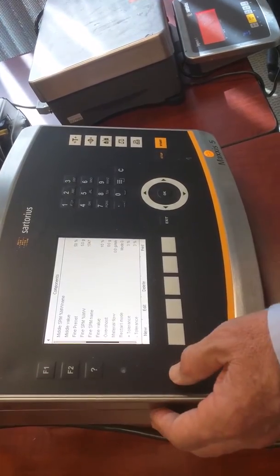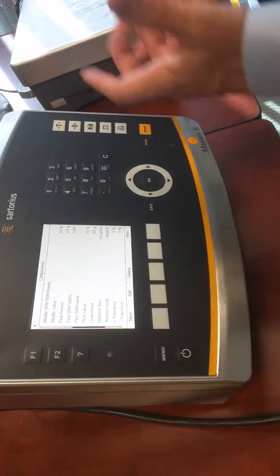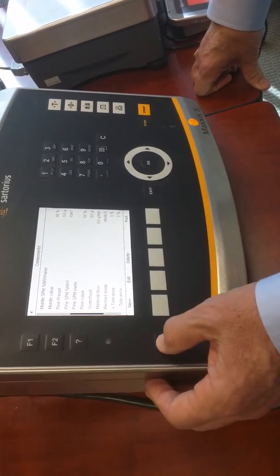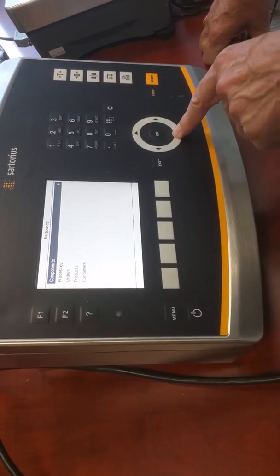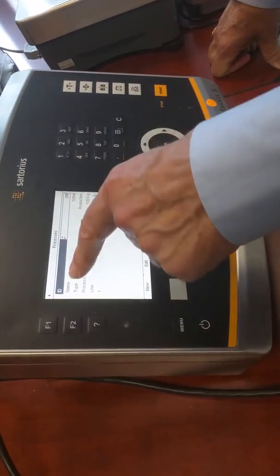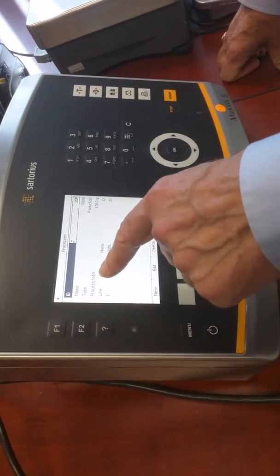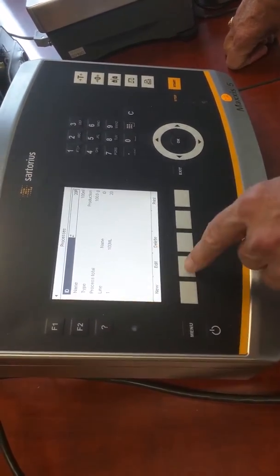So it puts some limitations on what you can select for a fill volume. You'd think that you'd need to be at least above 10 grams in order to make this work, otherwise it'd never get to 100%. So we'll hit exit, and we'll go to processes, arrow down, hit OK. All right, and so 20p, that's the ID, supposedly 100 mils. So process total is 100 grams and or 100 mils. So we can edit that if we wanted to.